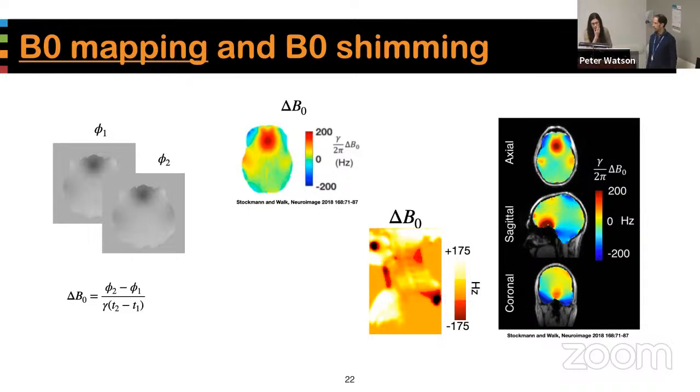Yes, for sure. So if you want to design coils to better shim the brain and specifically the front of the brain and around the ear canals, then you would want to start with field mapping in order to model what your coil design should be. When you build coils, you're going to have a model of what fields your coils generate, and you want those fields to be canceling what you're measuring with your B0 map. So you definitely need a B0 map.